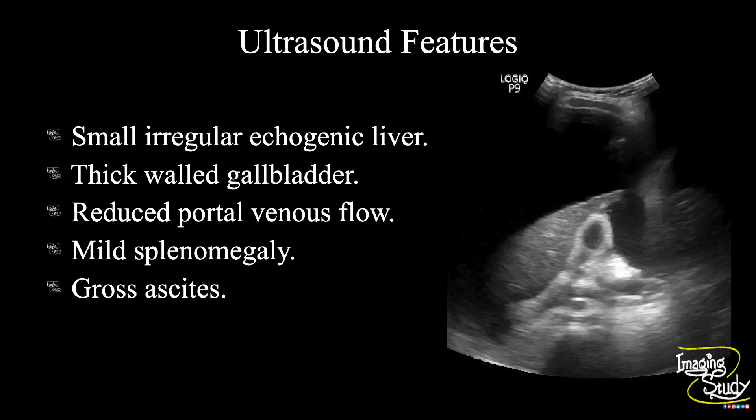In summary: a small, echogenic, irregular, coarse liver is noted. The gallbladder wall is thickened. The portal vein shows a reduced amount of flow. Mild splenomegaly and gross ascites are noted. These features conclude this as a case of cirrhosis of the liver.